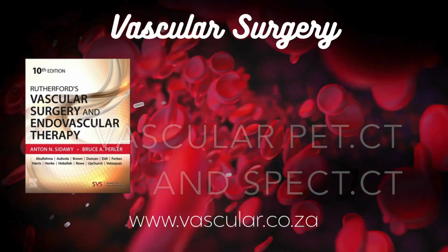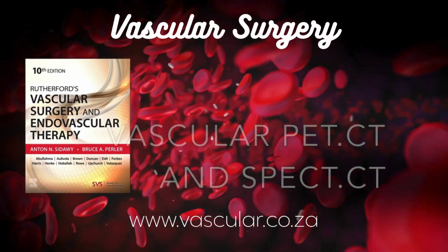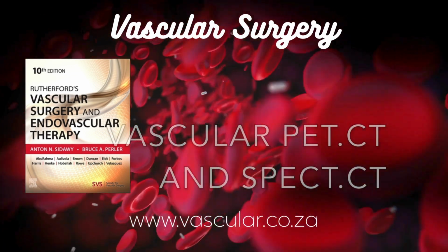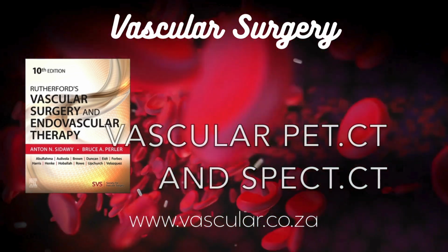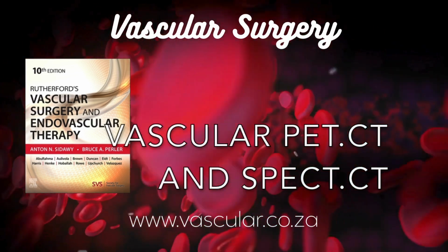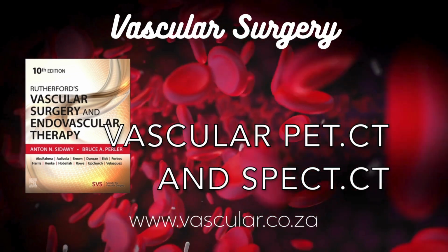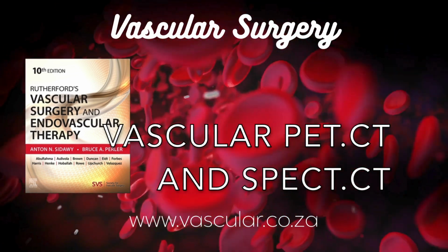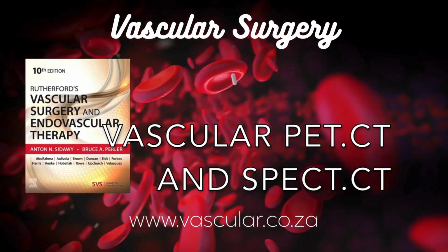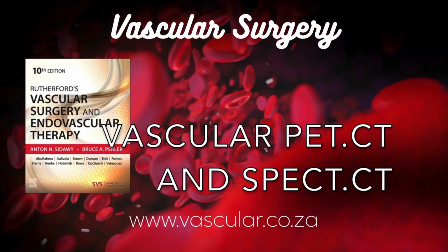Okay, so let's start there. What are the main shortcomings of the traditional ways of looking at blood vessels? Why do we need these newer tools? Well, like you said, the conventional methods, think ultrasound, CT angiography, MRI, they're really good at showing morphology, structure. Blockages, narrowing, aneurysms, that kind of thing. Exactly. They map out the anatomy very well. But they often miss the very early stages of disease, the physiological stirrings, if you like.